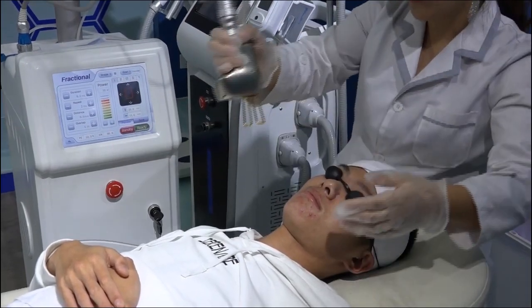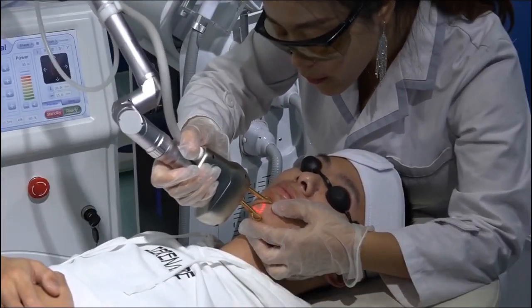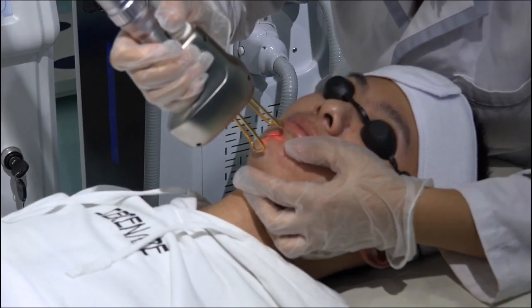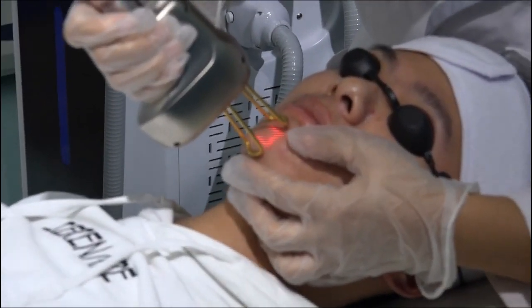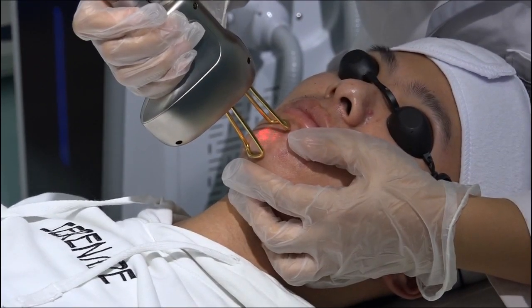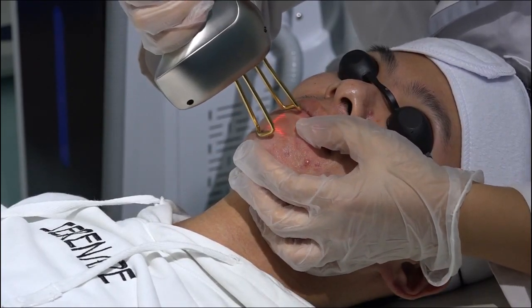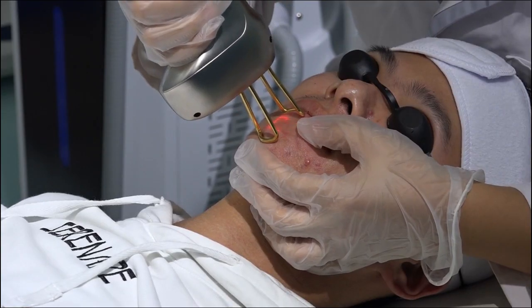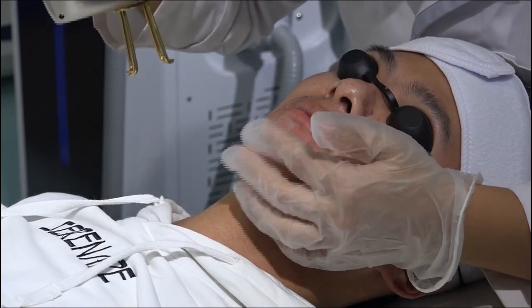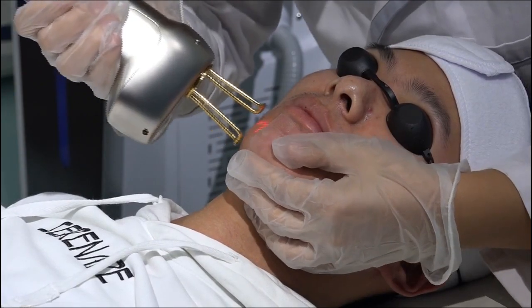Then we press the foot pedal and hold the handle like this.